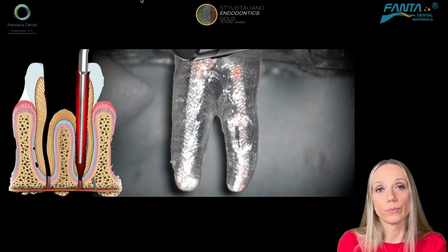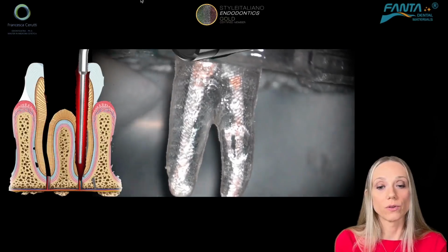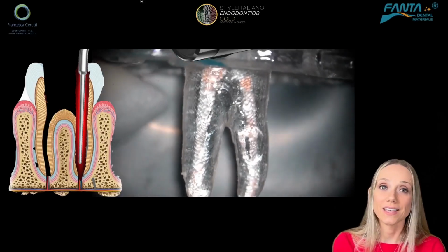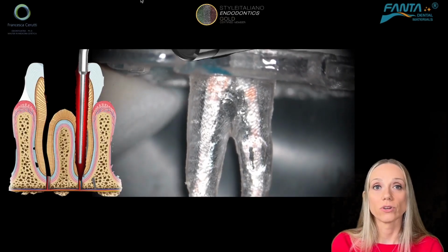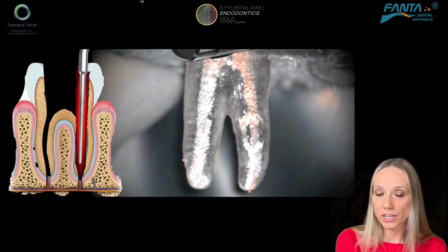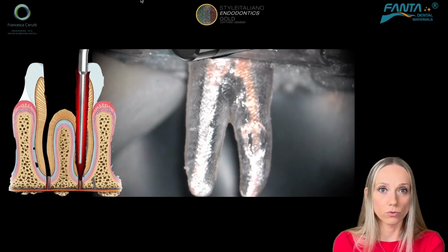And then what do I do? I have to deliver my heat carrier up to 4 millimeters from the working length. I can do it in a single step. I go like 1, 2, 3, 4, and I stay there and I stop heating. I stay there for 10 seconds because I want to allow the gutta-percha to cool down. And then I apply what is known as separation heat. So I heat again for a couple of seconds and I take my e-heater outside of the root canal.